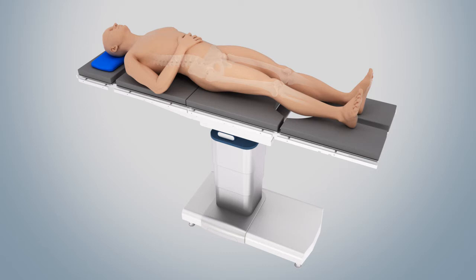Implantation of a total hip endoprosthesis can be carried out in the traditional manner with the patient in a supine or lateral position, using various surgical approaches. In our training video, the patient is positioned in supine decubitus. In the present case, the operating surgeon prefers the minimally invasive anterolateral approach, according to Watson-Jones. However, the cup can be implanted via all common surgical approaches.